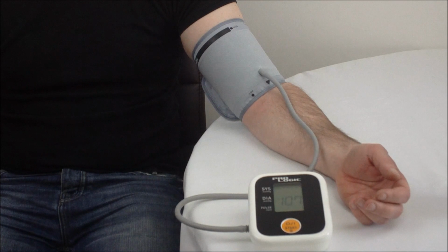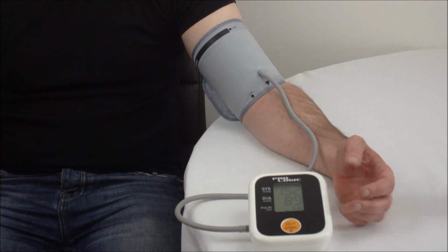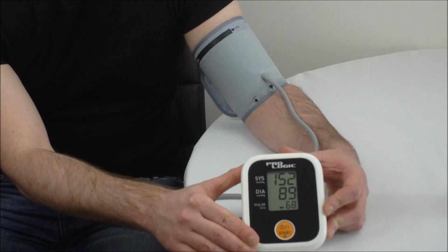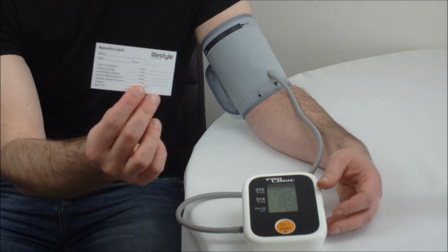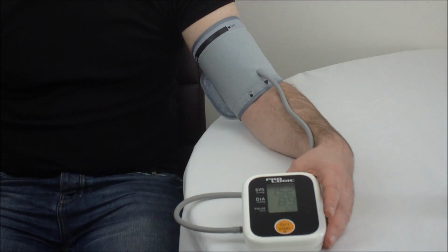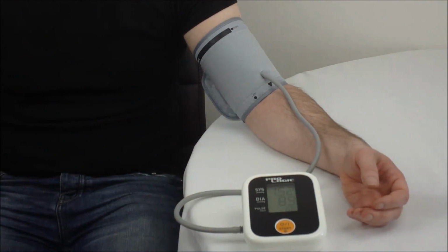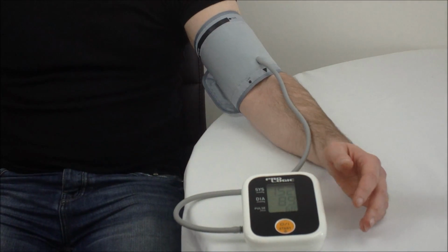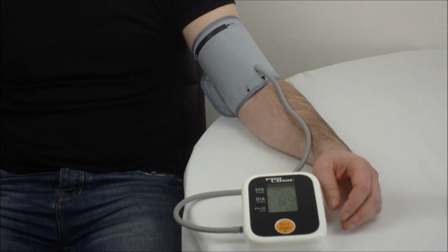If you do sneeze or cough or talk or move, then you will have to repeat this test. The blood pressure machine will count down and will display a top number and a bottom number, and you can use this to write down on your results card. But we're not done yet, because in order to get an accurate blood pressure measurement, we're going to have to do this 3 times. So what you need to do now is sit back and relax and wait for 2 minutes to pass, and then repeat the procedure.